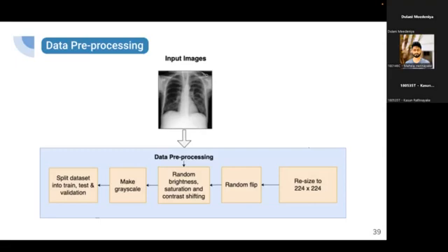We have used techniques like resizing, flipping, applying random brightness before the training. These techniques helped us in achieving consistent image quality across the different chest X-rays, generalize the model across a large range of images, and also to reduce the unwanted noise present in the images.